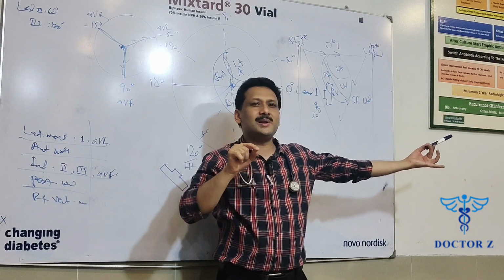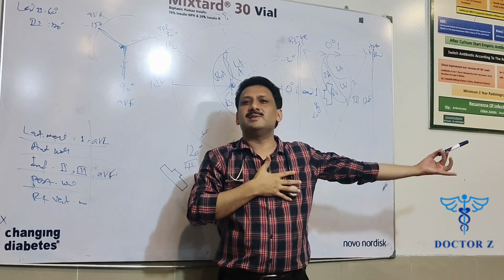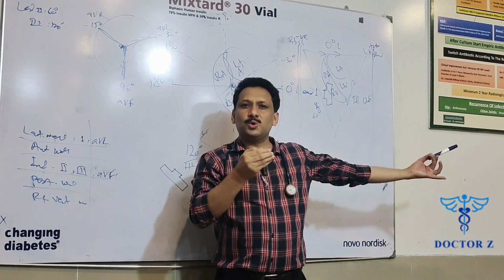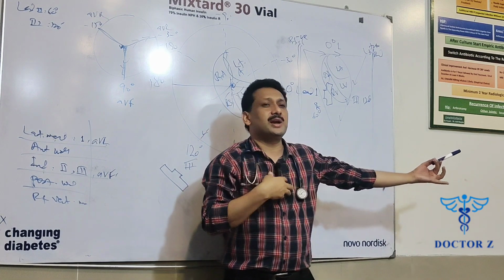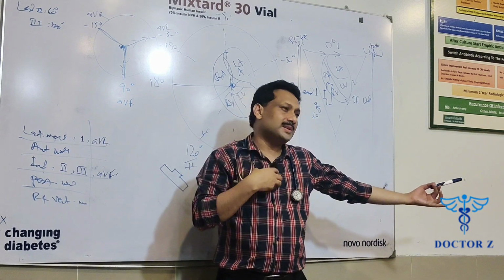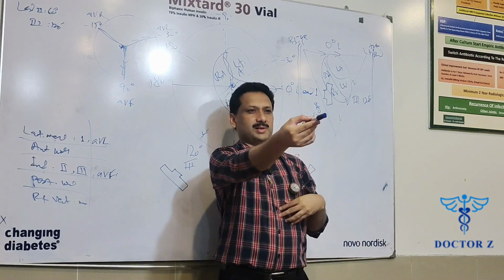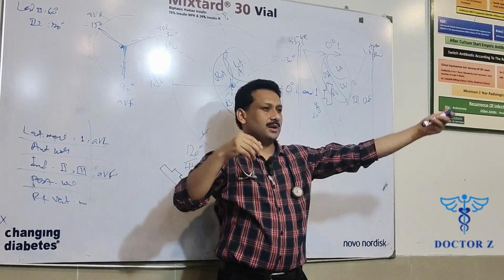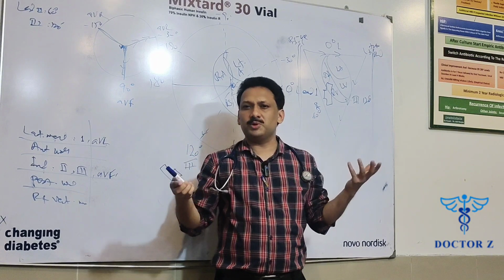Now I am going to place cameras because the biggest wall of the heart, the most important and significant one, is the anterior wall of the left ventricle. I just want to know the information about whatever is happening in the anterior wall. So where to place the cameras? We will be placing chest leads, but now we will be using horizontal cameras. Initially the vertical ones were in that direction. Now I'll be placing my camera here. That's the simple thing which we do.